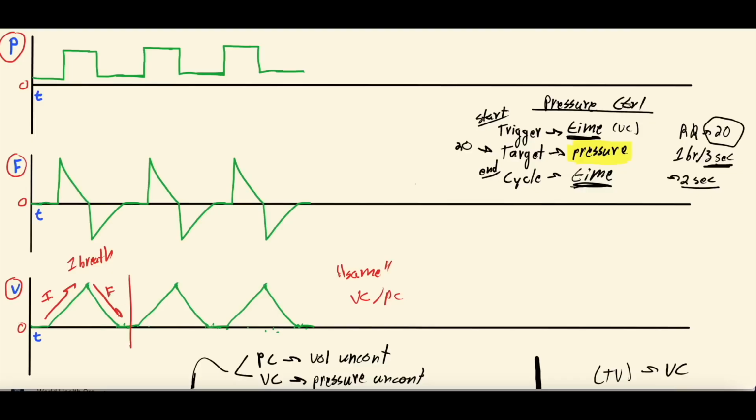That's when the patient is expiring, or breathing that air out, right? And this is going to be your whole breath, your tidal volume, 400 cc's. They inspire to 400 cc's and then they breathe it out. And it should go back to 0 after each breath, because you are expiring the same amount of tidal volume that you inspired. And if this doesn't happen, you can get breath stacking and some of these other things.